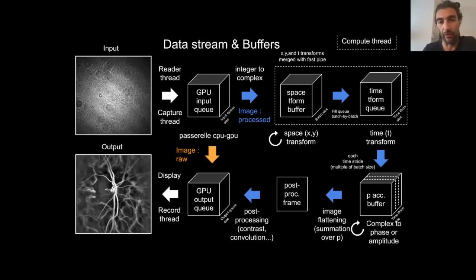the arrival of all of our data, and we pick up blocks of data, quite important, like series of images, that we want to transform, to demodulate spatially and temporally in a compute thread.